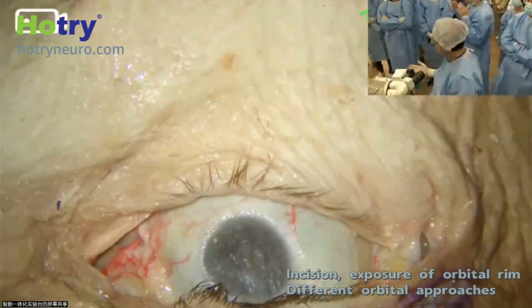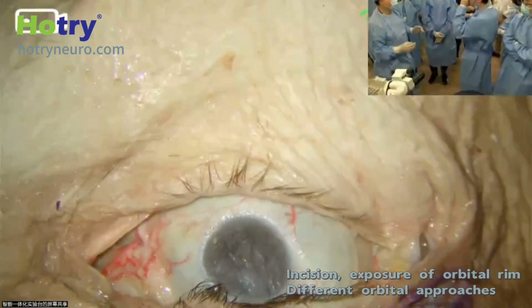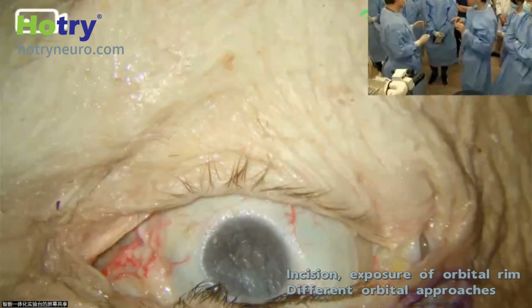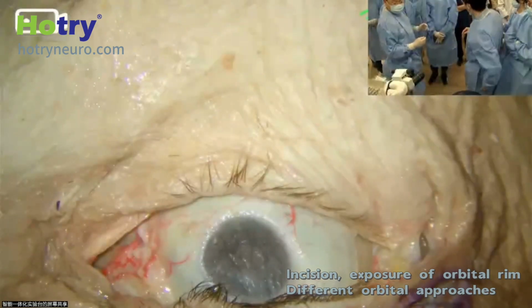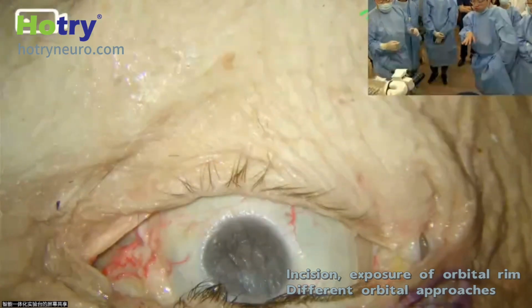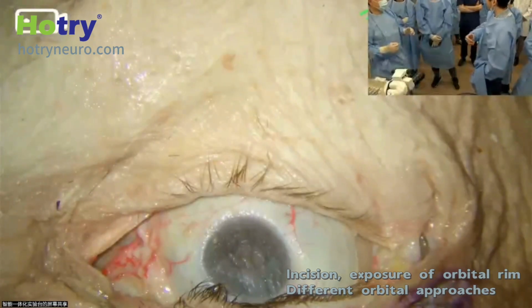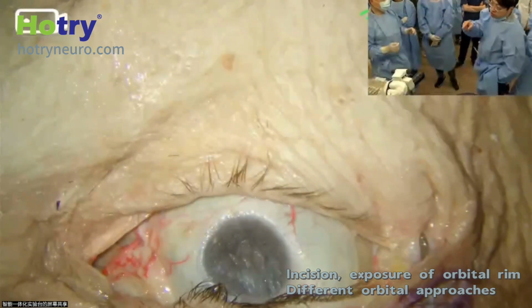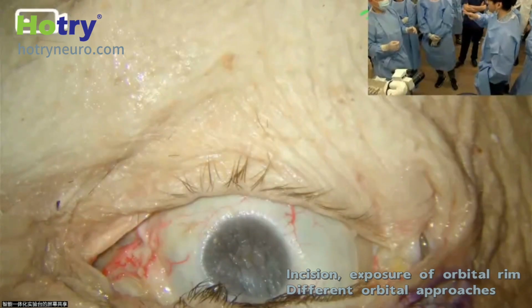Let's divide into groups. Now, the first part, I think all of us are either neurosurgeons or surgeons, so probably this is the first time that you've done these different orbital approaches, if you haven't attended other orbital-related or transorbital courses before. So for the positioning, that's a good question. You stand or sit at the top of the head of the patient first. You're divided into 5 groups, so you might not want to fix the head first in the main view. Just do the incision first, the 4 incisions.